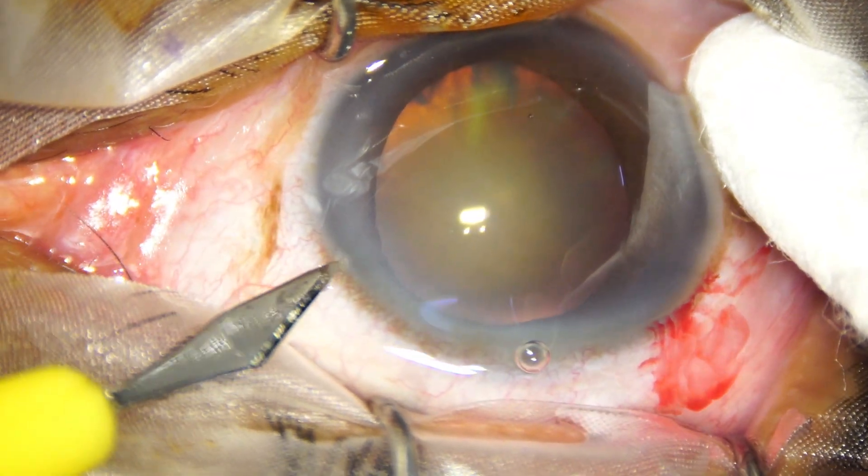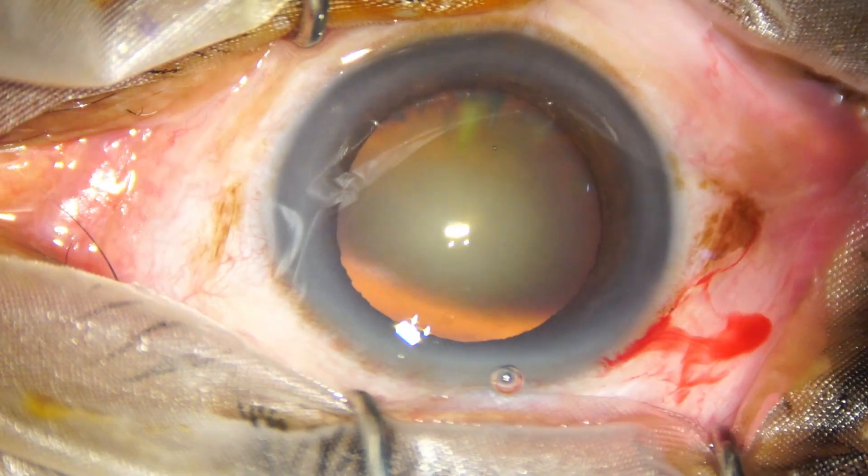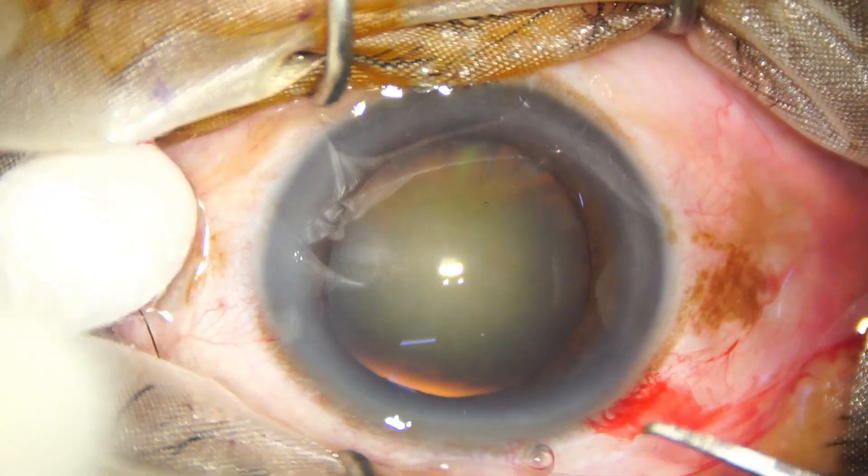A side port is made on the left side of the main wound, about 3 o'clock hours away. Now, capsulorhexis is done.